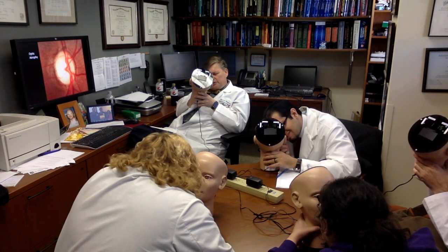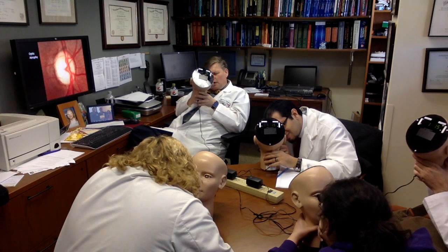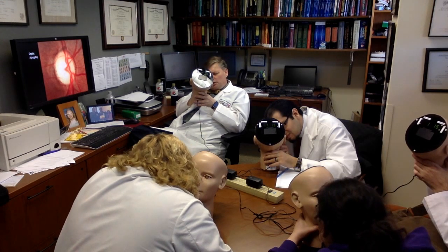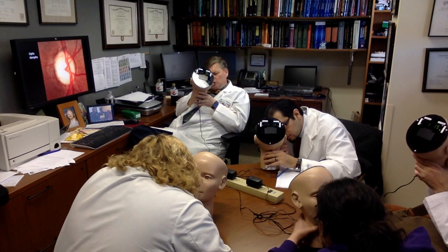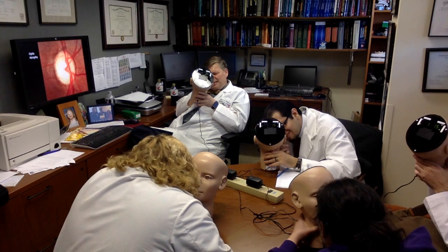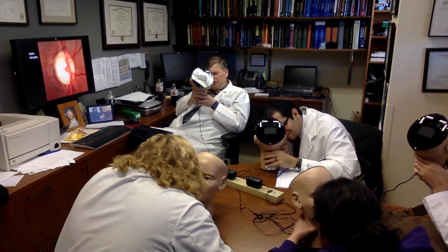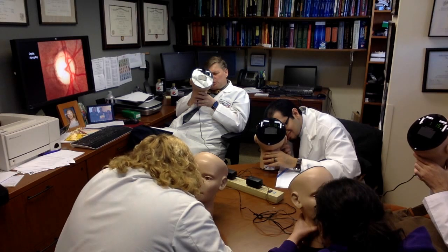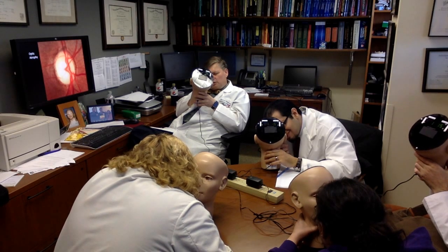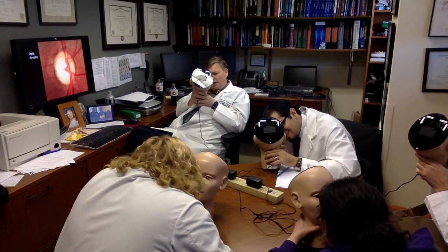You say, oh my God, this is really papilledema. I'm not seeing any cup. The disc is totally blurred. The blood vessels are really tortuous. And if I look at that one vein at 6 o'clock, you say, well, that may run down. However, you see other things. You see all the white spots. Those are cotton wool spots. Those are retinal infarcts. Then, do you see all the hemorrhages right off the disc?